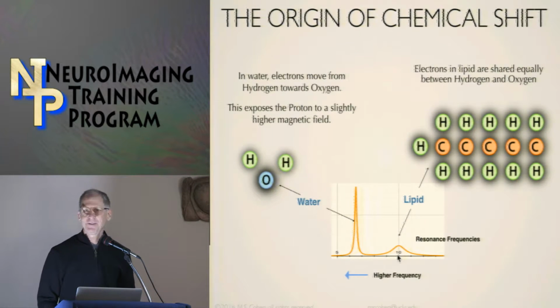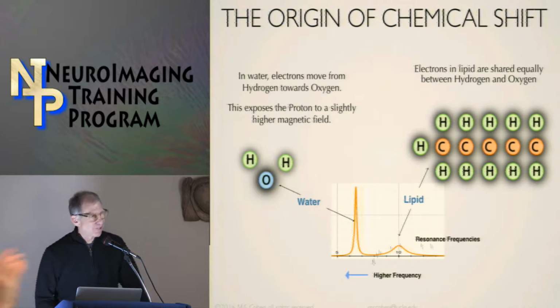Mayonnaise, as many of you know, is made by basically mixing oil and water, oil and eggs, and in almost equal parts. So what happens over here is that the water, and this is a weird convention having to do with spectroscopy, the water precesses at a different and higher frequency than the lipids do. Okay? We make sense of that? Any question with that? Okay.